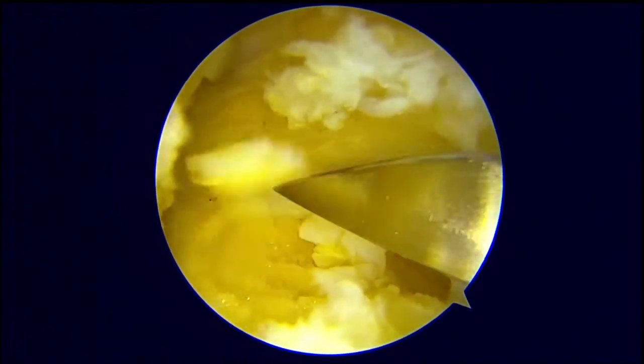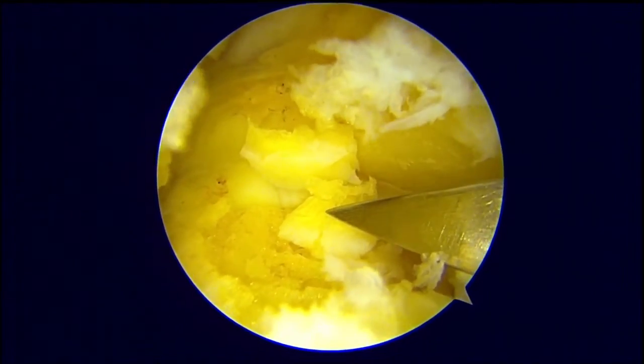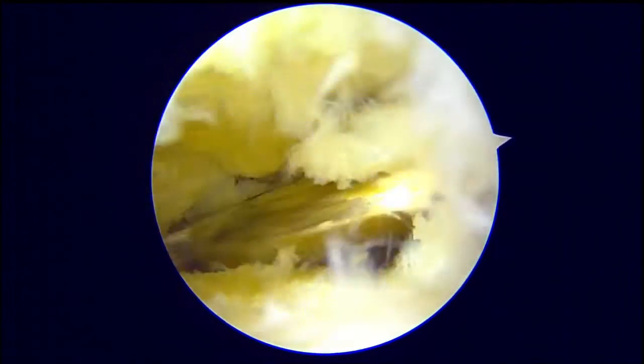After optimal position confirmation, we proceed with removal of cartilage from the posterior aspect of the subtalar joint. We do not touch the coalition, as this is a neutral alignment of the hindfoot. So we only remove the cartilage lateral to the coalition.